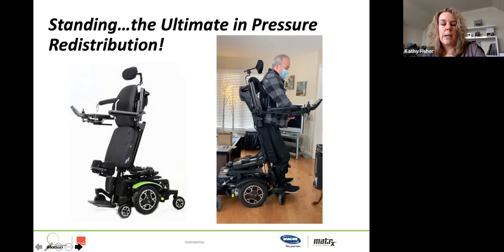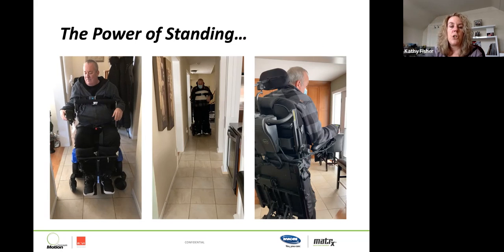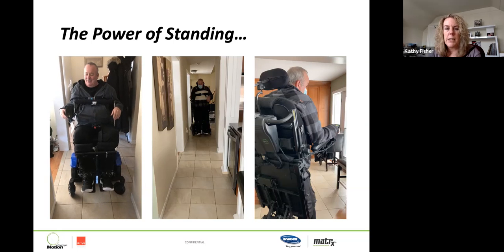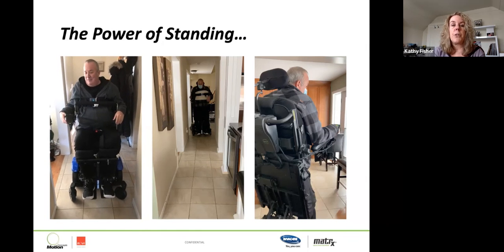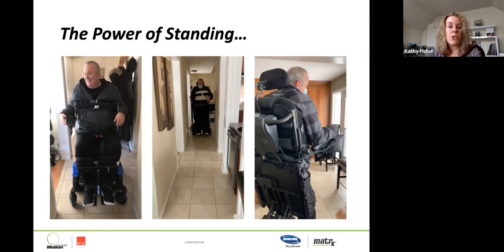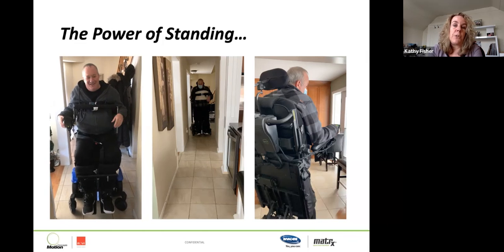So he came to us and said, I think I can get some funding. He was in a motor vehicle accident. I want to be able to stand, and I need a powered chair. I'm realizing that I can't live my life in many places with just a manual chair. So pre-COVID, this is him in his initial trial setup. We didn't know how it was going to be. We knew he'd been in a standing program, so we knew it was safe for him to stand. But he was trying to see if it would fit in his house, if he could be functional in it, and was it worth the investment to be able to do this?